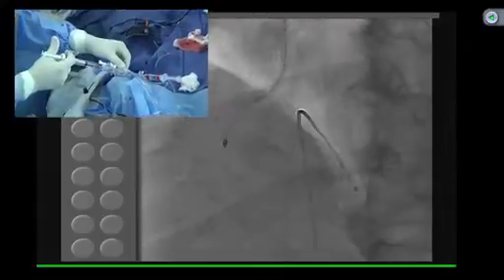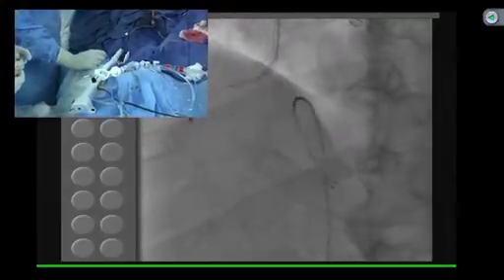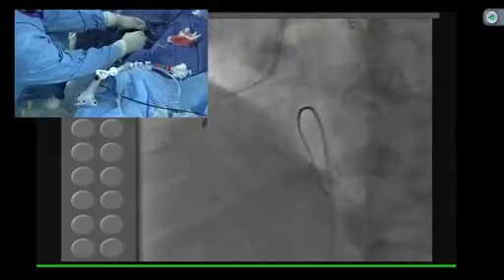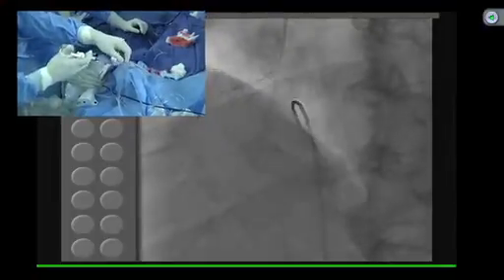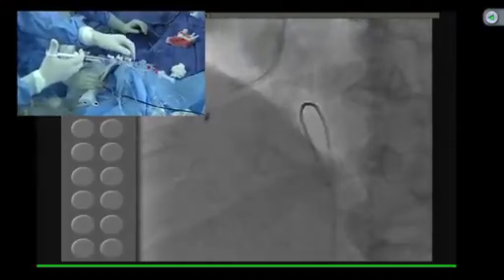If with these 3 steps we still think the burr is still in the proximal RCA, and there is no movement of the burr or trying to get the burr further, the guide is kicking off. In that situation we have to think of doing it with the Dynaglide. So right now I think we just start the rotational atherectomy. I am just going to tap on the Dyna. There was no movement of the burr, and just start.